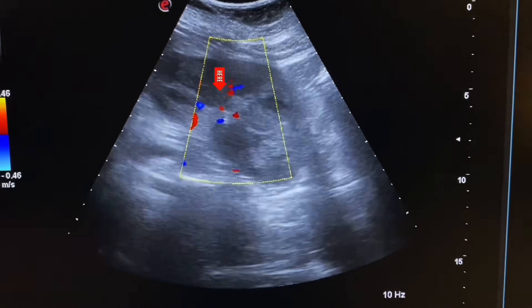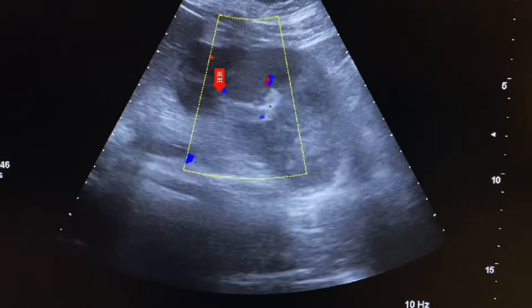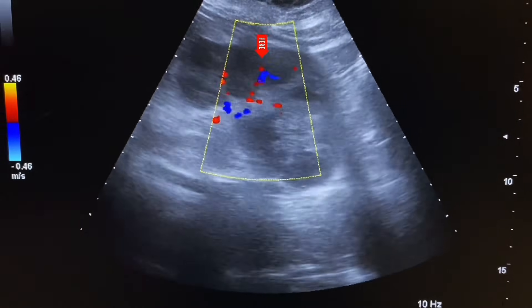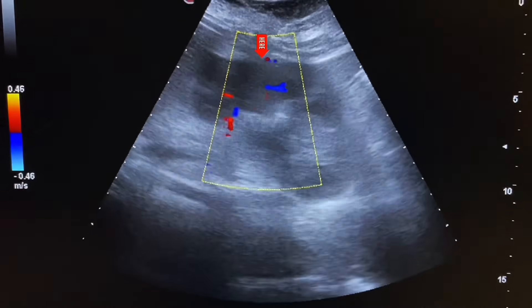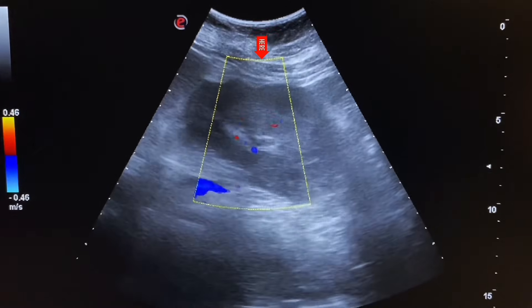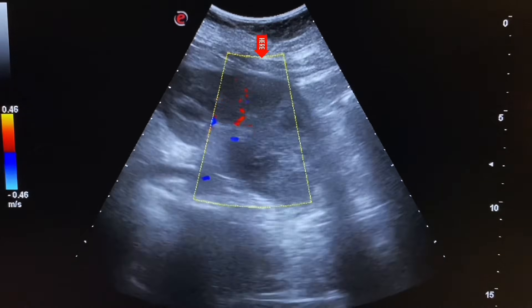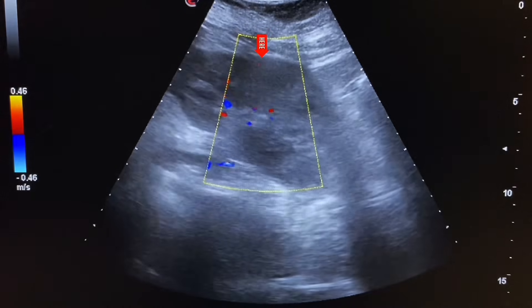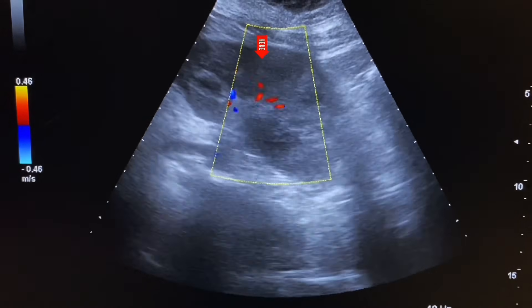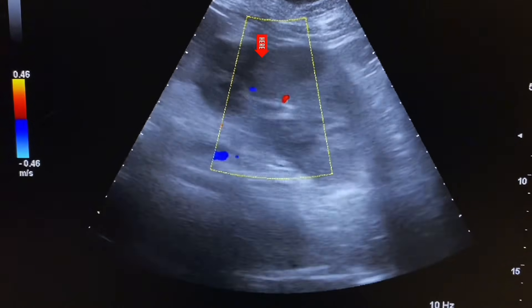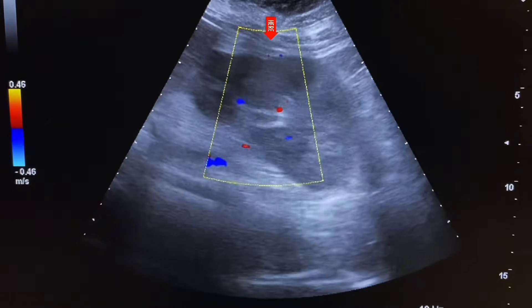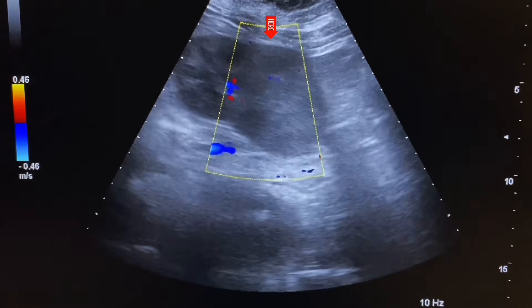Here we also see the interlobar arteries which run along the pyramids of the kidney. No internal flow is seen in the other focal regions.